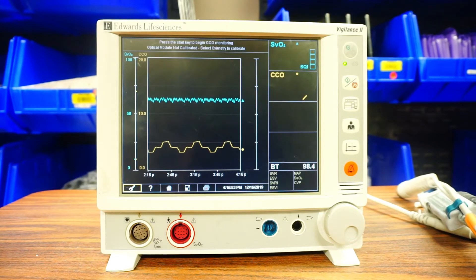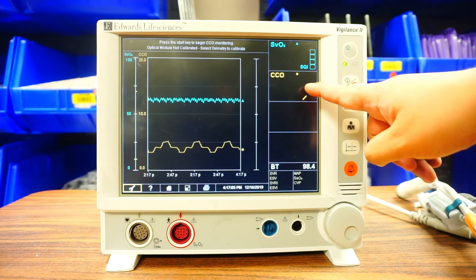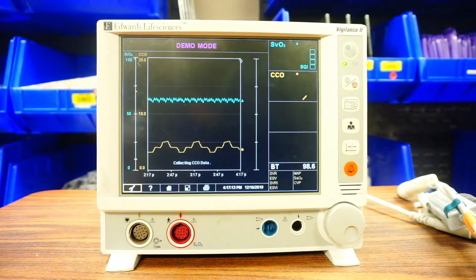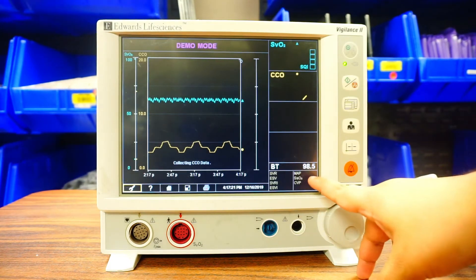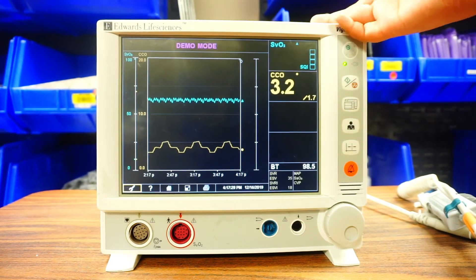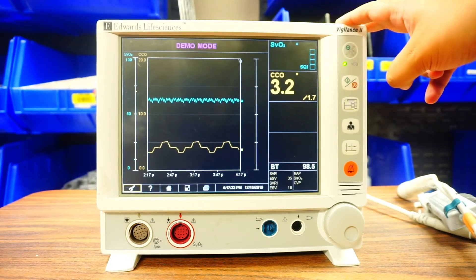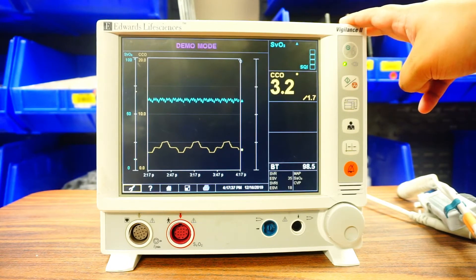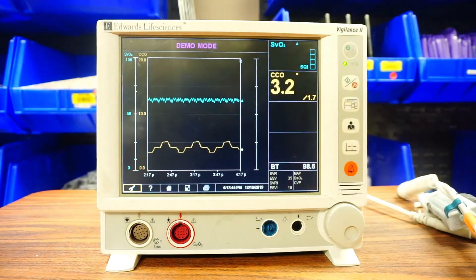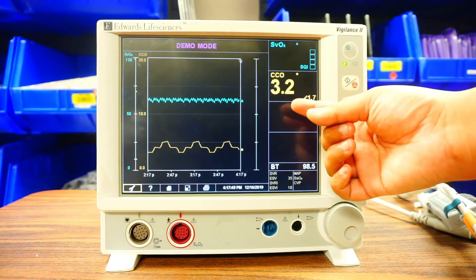I went ahead and put the monitor in demo mode so you can see some numbers since I'm not connecting this to an actual patient right now. To get your cardiac output running, similar to the other machine, you press the green go button. After about a minute it will calculate your cardiac output and cardiac index. Your core temp is shown down here, along with your time and graphic trends. A limitation of this machine is that you cannot see previous numbers — if it's been three hours since you last recorded, you won't be able to retrieve that. To get accurate readings, you'll need to check every hour.